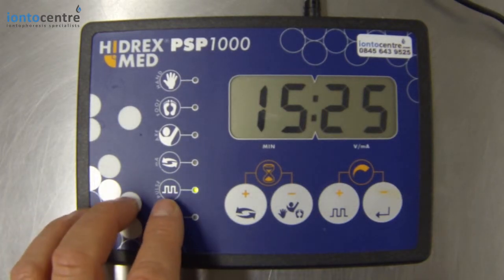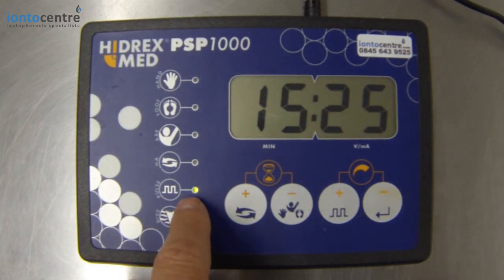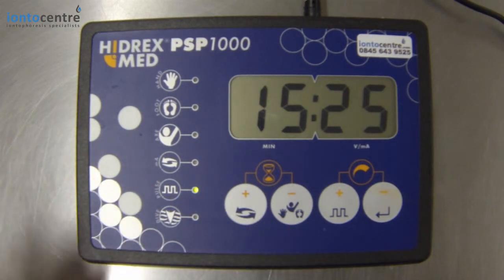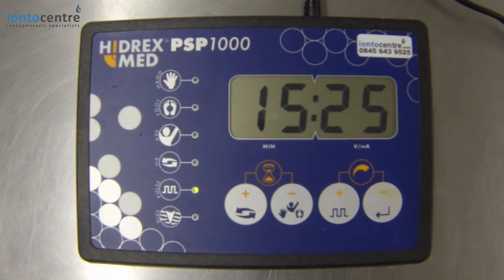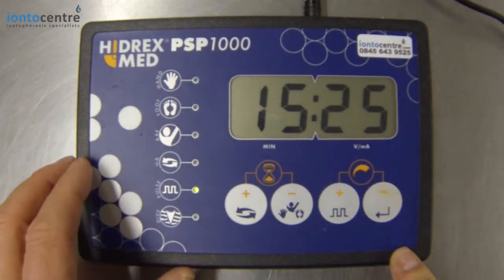We recommend pulse current. If the pulse current LED is on, that's telling you the machine is in pulse current. We generally recommend that for the underarms, the hands, certainly the face, the torso for compensatory sweating, and for younger users, because pulse current gives a much milder treatment. The only time we really recommend direct current is when you're treating the feet.